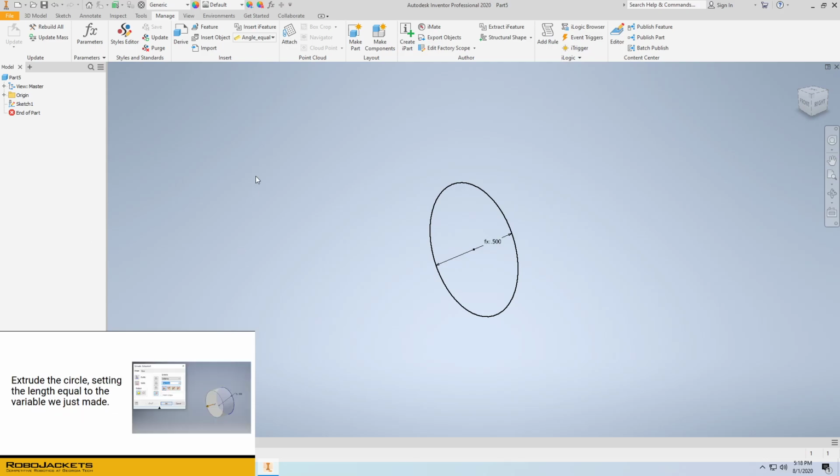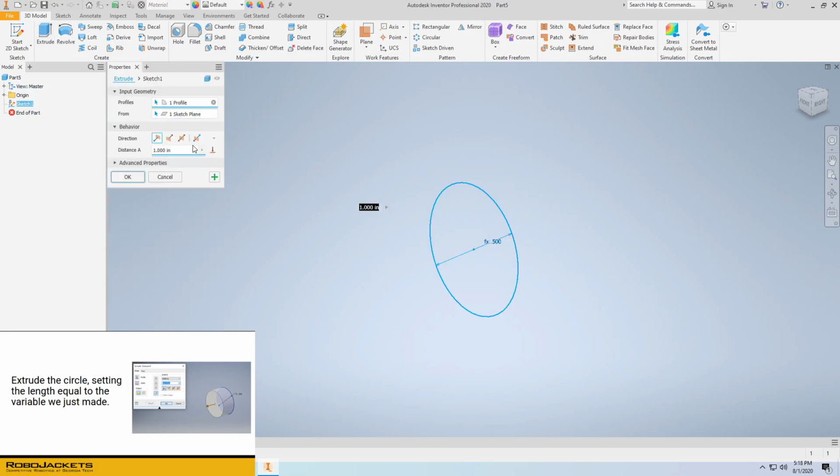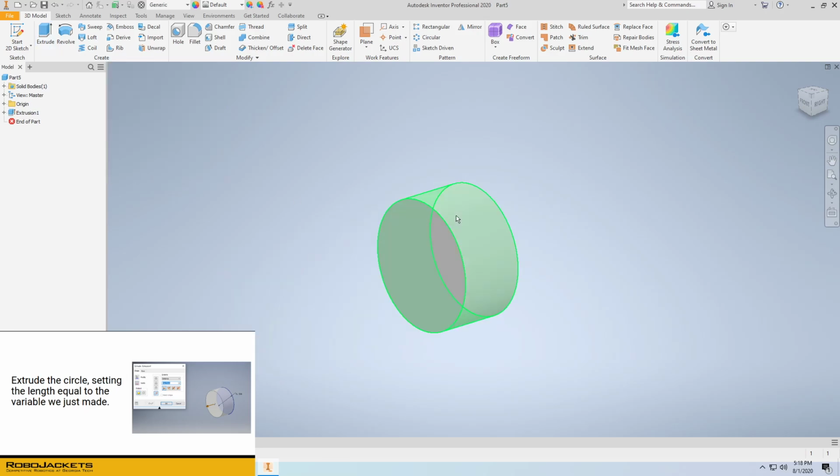So now, using that new parameter, we'll go ahead and extrude our new sketch a distance equal to main thick. Here we go. And so nominally, the thickness of this is 0.25 inches, but it is dependent on that main thick parameter. So you can change the parameter and it will be reflected in this feature.